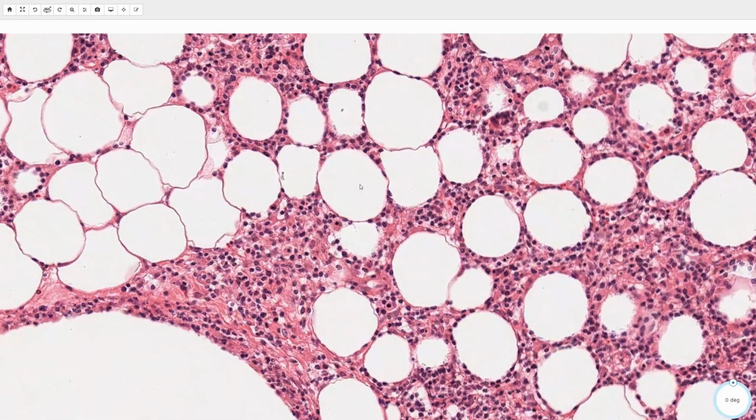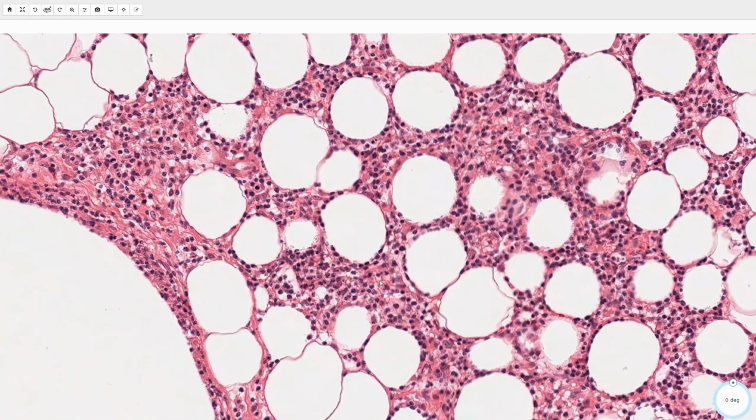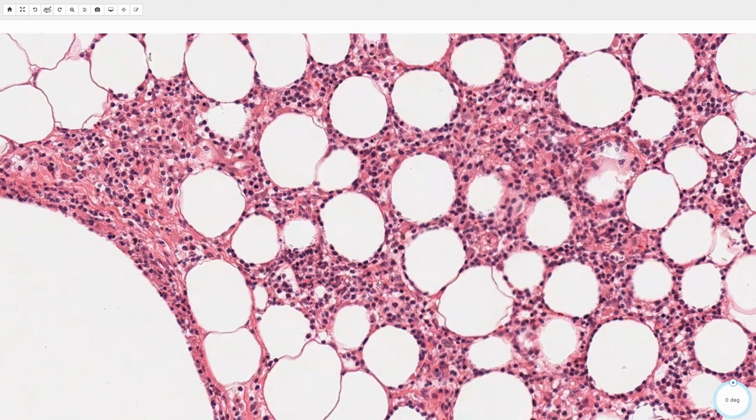What you typically see here are these beanbag cells. So you will see macrophages that are stuffed with debris of many different cells. And you see remnants of polymorphic karyorrhectic debris and histiocytes with granulomatous features.